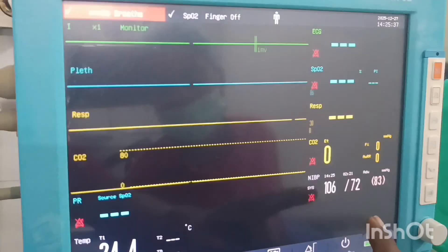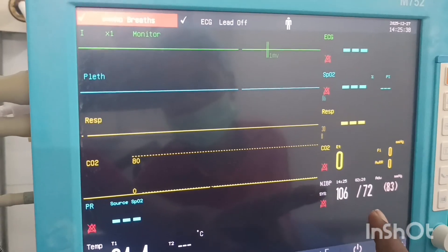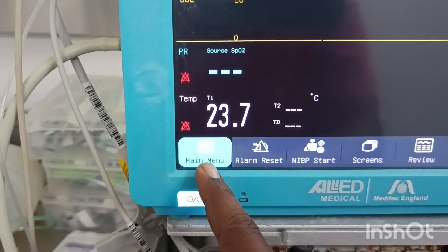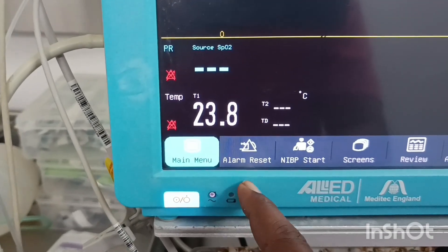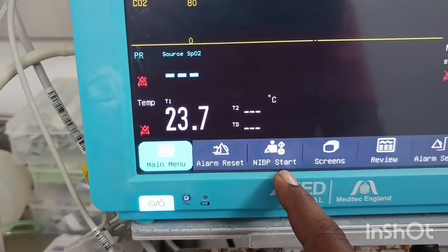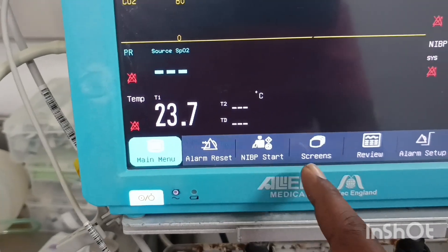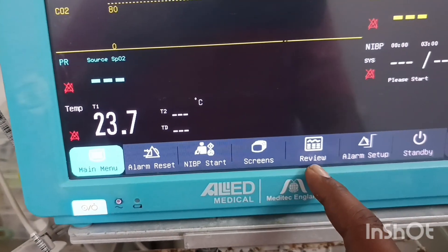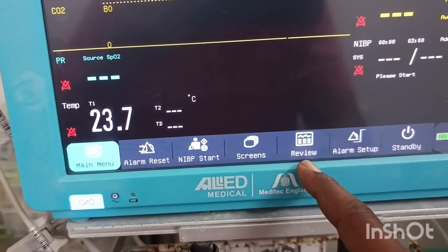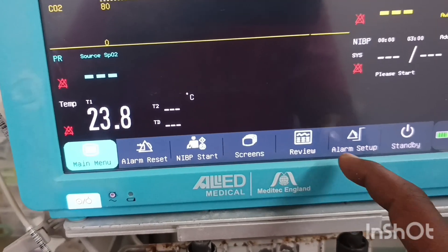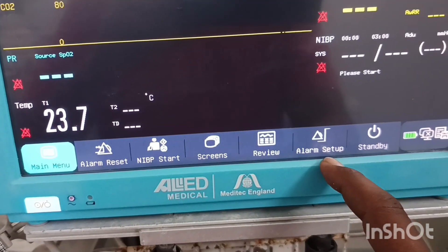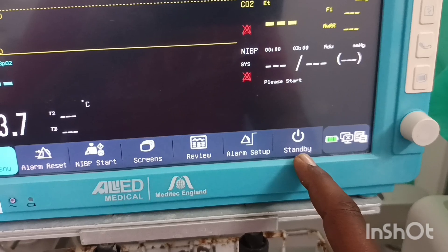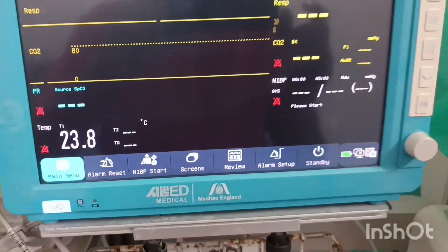This is the blood pressure. This is the main menu and alarm setup. From the NIBP start, you can see the screen and review all the vitals and alarm setups. We can also put the monitor on standby.